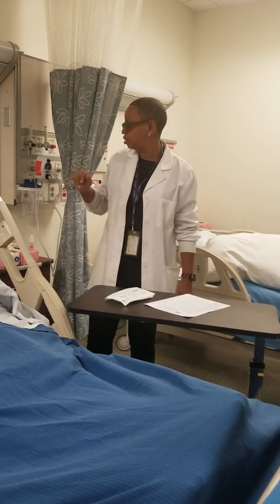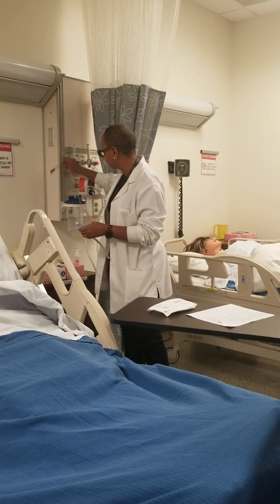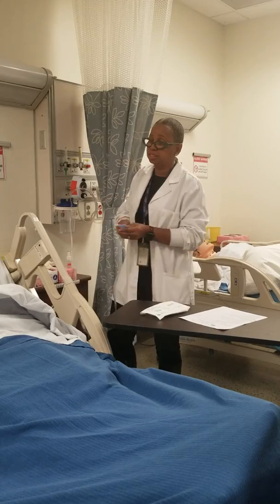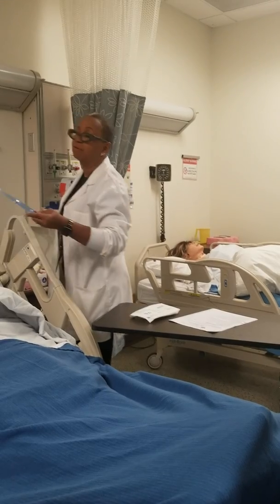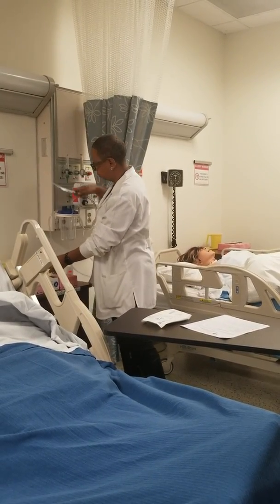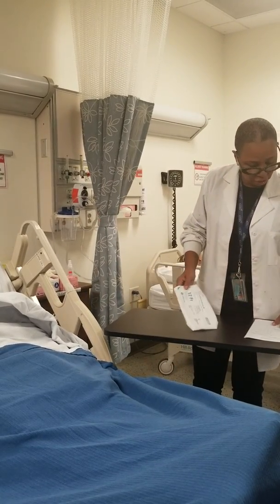If he has secretions in his mouth, I can also hook it to a yanker and get the secretions out of his mouth. Sometimes people have secretions in their mouth. This is the yanker, so you can go in his mouth. Trust me, this is not what you use to go down here. This is only for his mouth, okay? It's a yanker. Two different suction devices. So I have my suction catheter kit. What else do I need to go along with this?